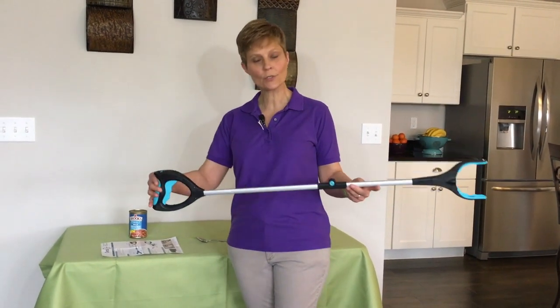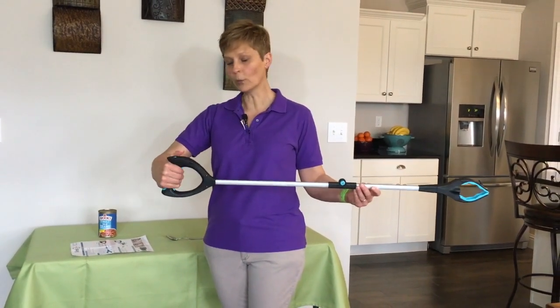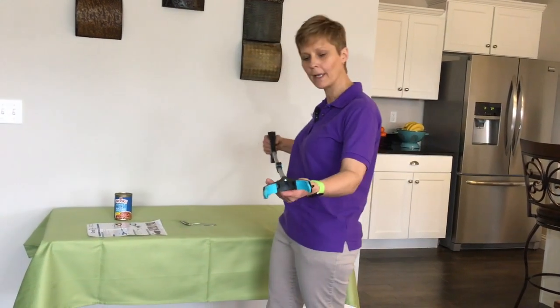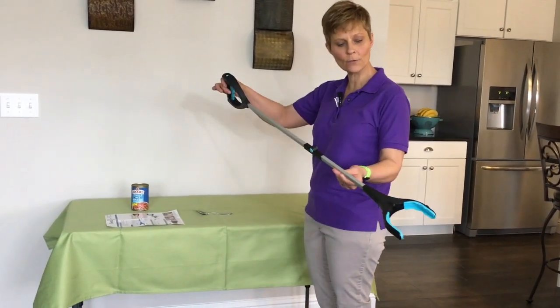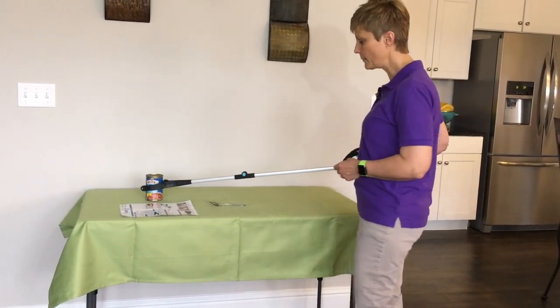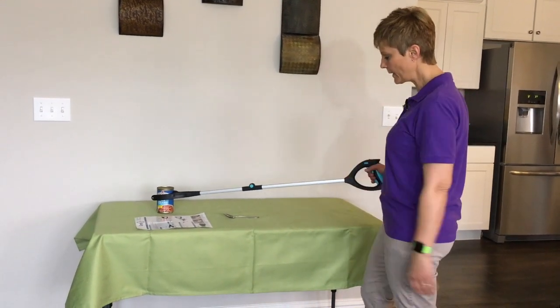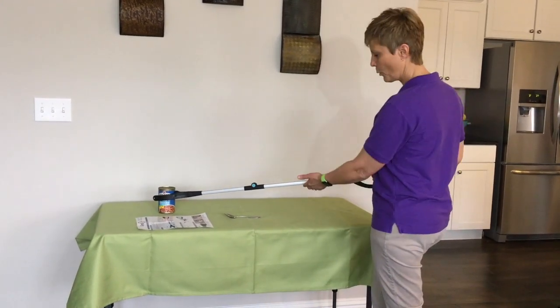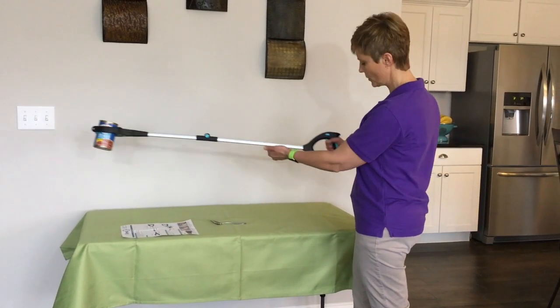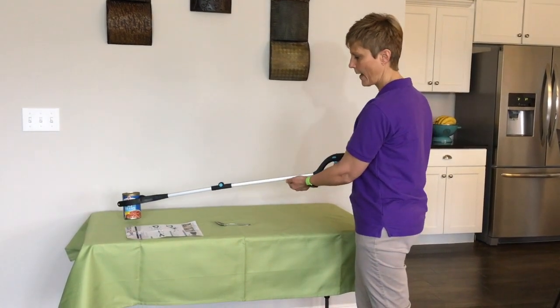First thing I'm going to do is just demonstrate the standard feature where I'm just pulling in with my grasp and grabbing onto something. So we're going to use this can here and I'm going to use it in the horizontal position. So if I come up and I'm grabbing this can, I'm just using a standard grasp here — I grab a hold of it. Raising it up, and there you have the standard feature of the grasp.